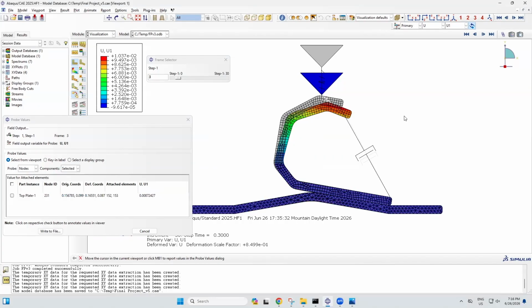U1 is staying approximately the same. This is due to the part moving down, but not necessarily being forced to the right anymore. In step 4, we can see that the horizontal displacement is smaller at approximately 7.4 millimeters. This is due to the part returning to equilibrium. Similarly, with U2, or the vertical displacement, the displacement is a little bit smaller at 1 centimeter.